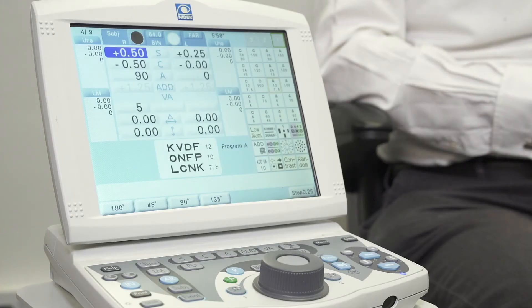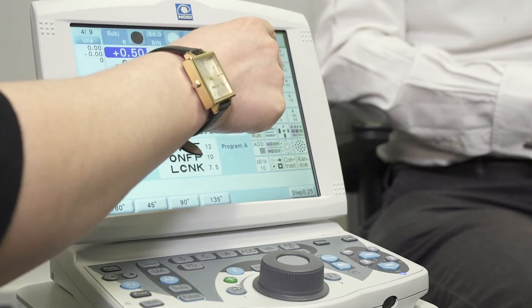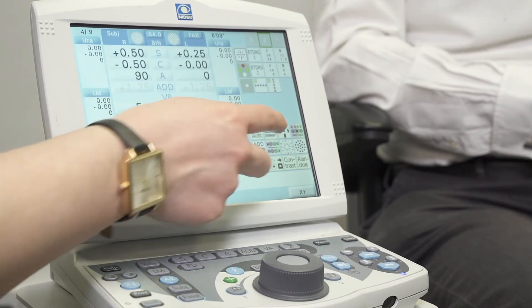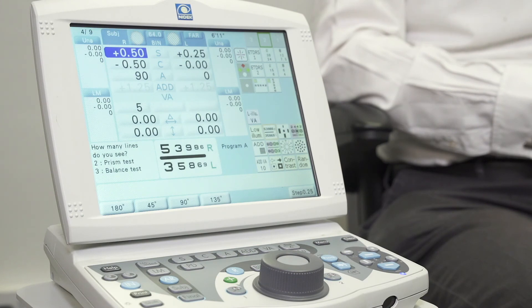Once we have a finalized distance prescription for both eyes, we can move on to our binocularity testing, and that may be our fixation disparity or it may be binocular balancing by using the binocular balance function here.